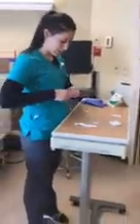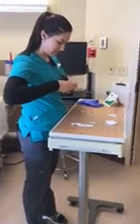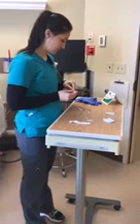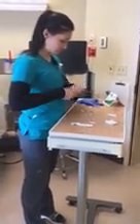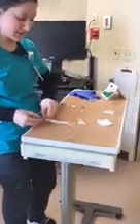That down there, and I'm going to dispose of this in my sharps so I don't get stuck. Okay, the next thing I'm going to do is prepare my needle and get it going. There we go, and that is on my sterile surface there.